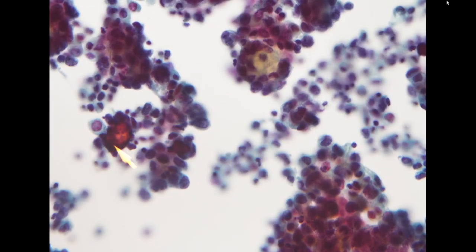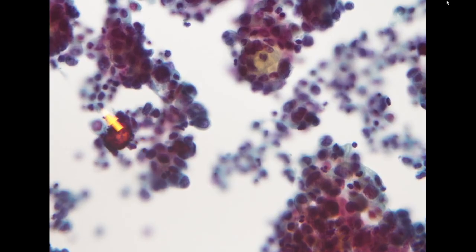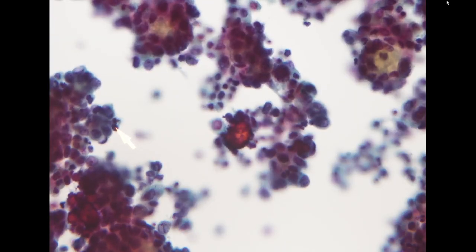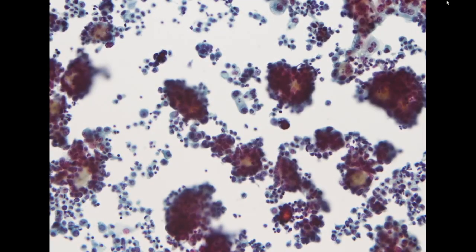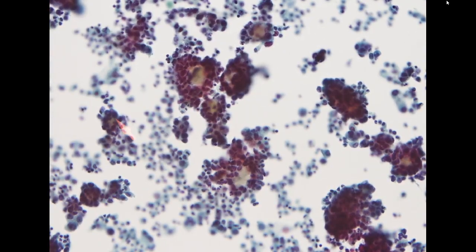Okay, so you can see particularly this one is a concentric psammomatous calcification. This is very typical for advanced stage ovarian cancer, particularly for high-grade serous carcinoma. You can see psammoma bodies over here, right? So this suggests that the tumor already involves the peritoneum.